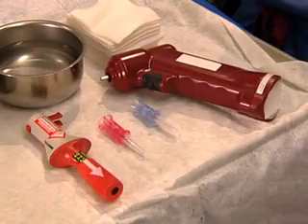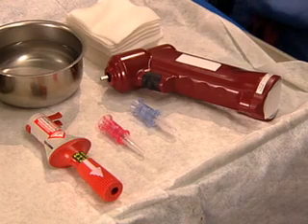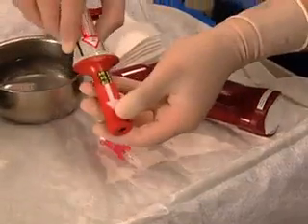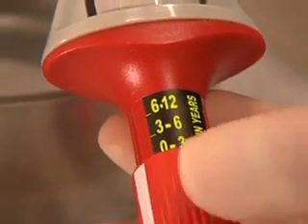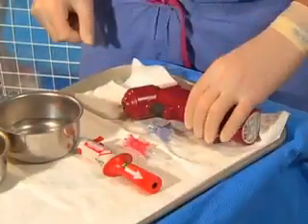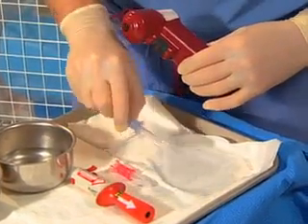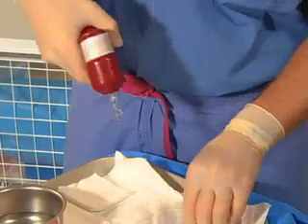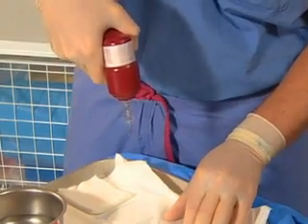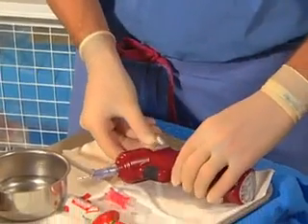Power-assisted devices have been shown to improve placement time and success rates for intraosseous cannulation. Currently, 2 such devices are approved for pediatric use. A spring-loaded device allows the single deployment of a needle to a preset depth of insertion, which is calculated based on the patient's age. A drill-assisted device allows placement of either a pediatric or adult-length needle. The battery-powered driver and cutting needle facilitate penetration of the bony cortex, while the operator can control the depth of insertion by increasing or decreasing the pressure applied and by changing the length of time the drill trigger is depressed.